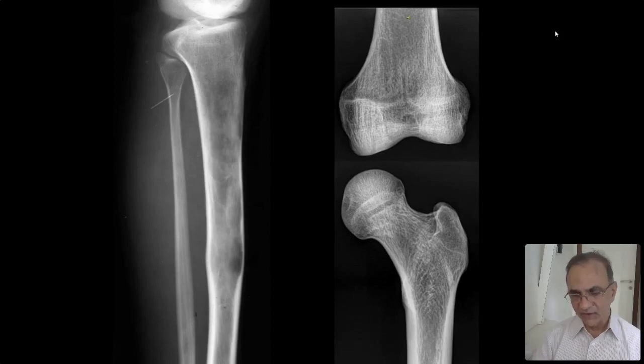So the first thing is trabecular pattern. You think about trabecular pattern, it's so fascinating, right? It's not a joke that we have this kind of trabecular pattern. It's not a joke that we get coarse trabecular pattern in the diseases that produce coarse trabecular pattern. And you have to think about what is coarse trabecular pattern? Where does it come from?